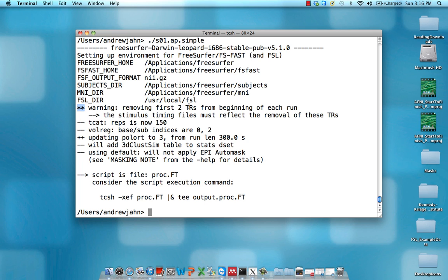Why that's important is that can affect how your timing files are. The way they are right now in the sample data set are fine. We don't need to change them. But if you were to have any sort of alteration to the number of TRs in your experiment, make sure to also make the necessary adjustments to your timing files.